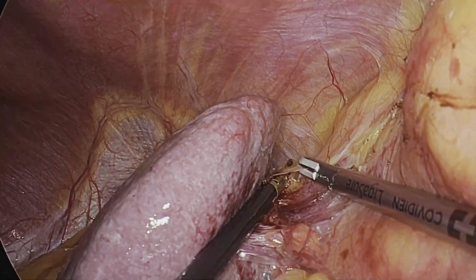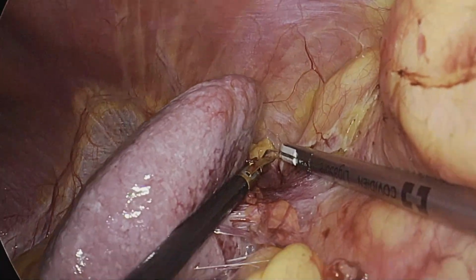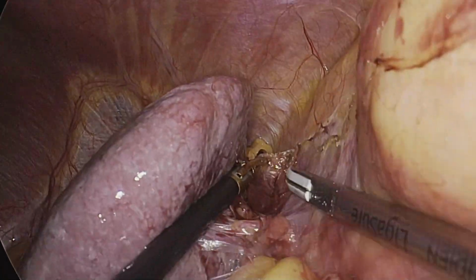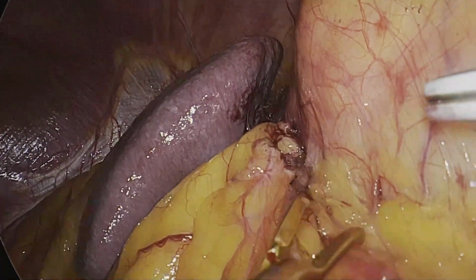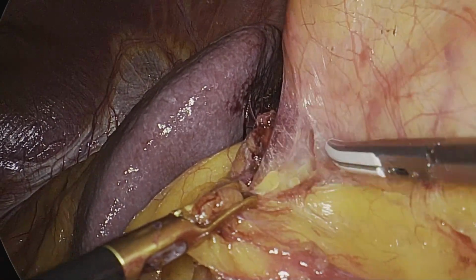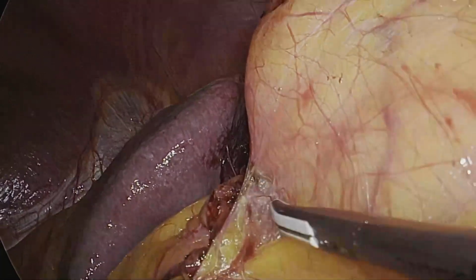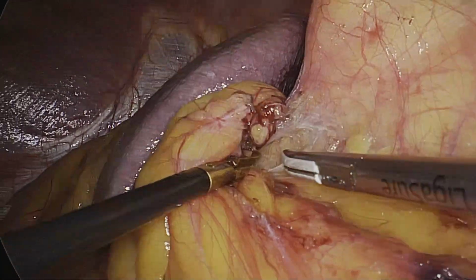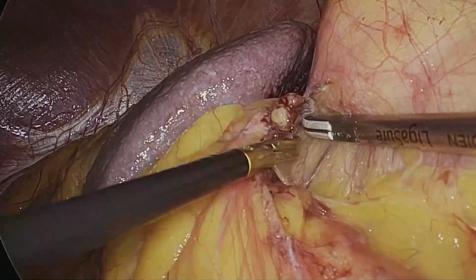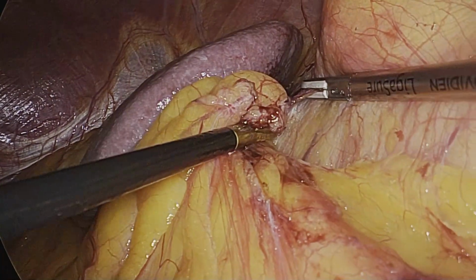The splenorenal ligament is being incised here, and the spleen should be mobilized well medially, so that the upper pole of the kidney can be dissected appropriately. We definitely want to separate the adrenal gland here. Removal of the adrenal gland is not necessary in every case of a radical nephrectomy. In this patient, the tumor is a lower polar tumor, and the adrenal gland is particularly normal.